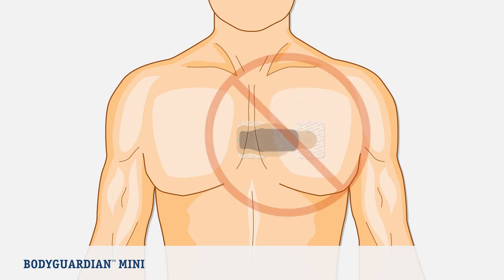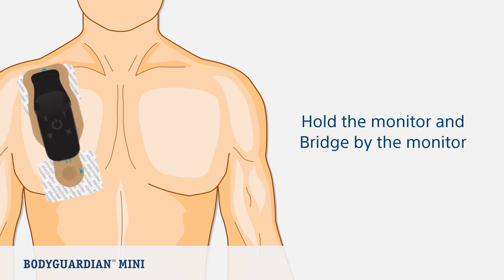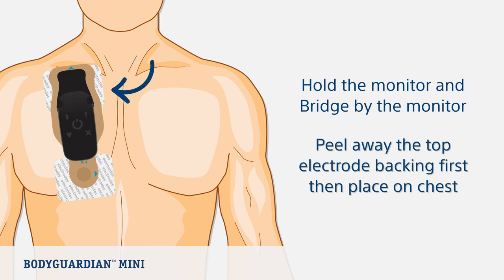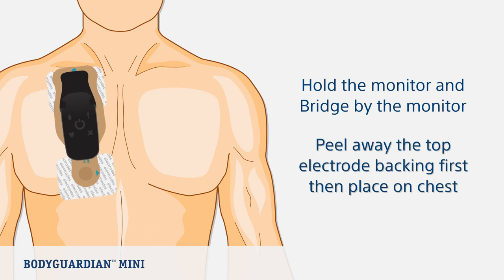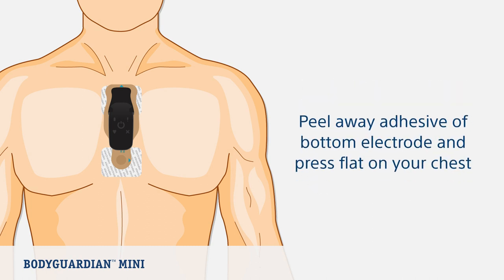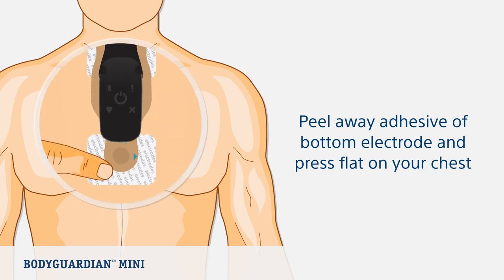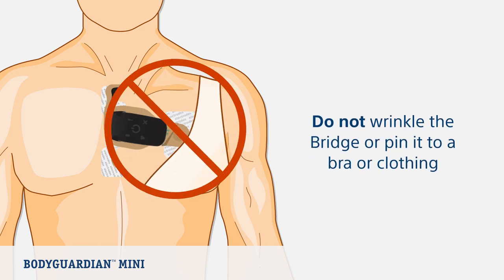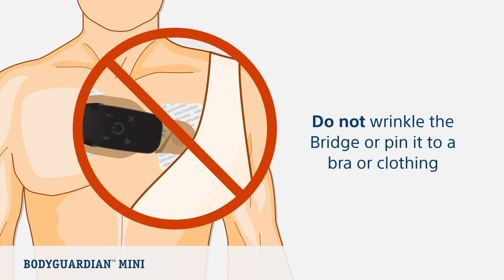To attach the bridge to your chest, hold the monitor and bridge assembly by the monitor. It is recommended to peel away the top electrode backing first. Then place that section of the bridge with the adhesive exposed flat on your chest. Once the top electrode is applied, slowly peel away the adhesive from the bottom electrode and slowly brush the bridge flat on your chest. Press around the surface of both electrodes to ensure the bridge adheres to the skin. Make sure the bridge is flat and smooth on the skin. Do not wrinkle the bridge and do not pin it to a bra or clothing.